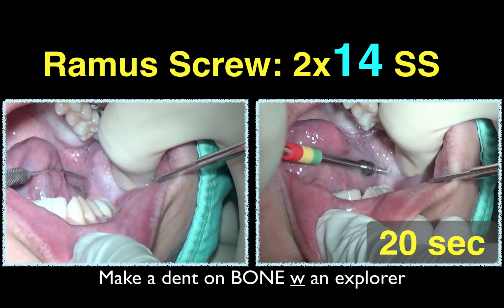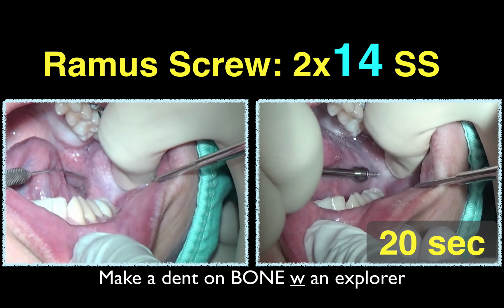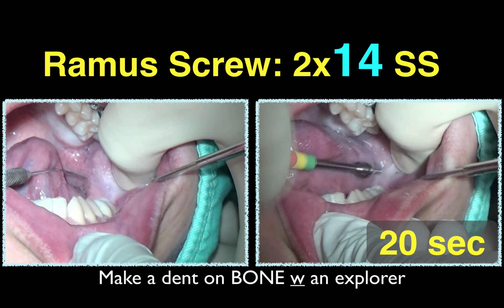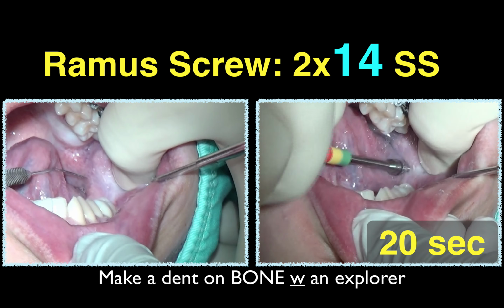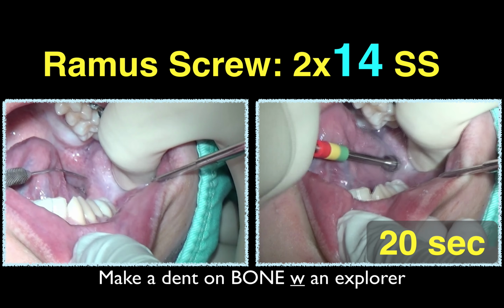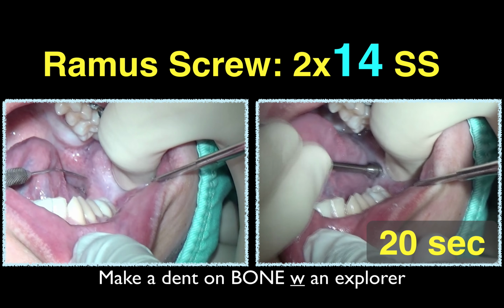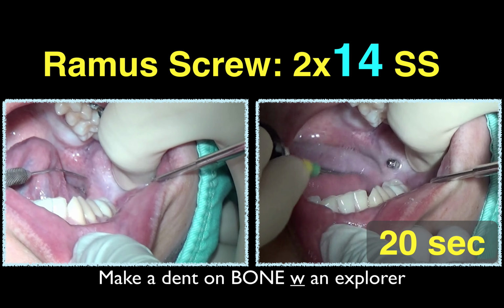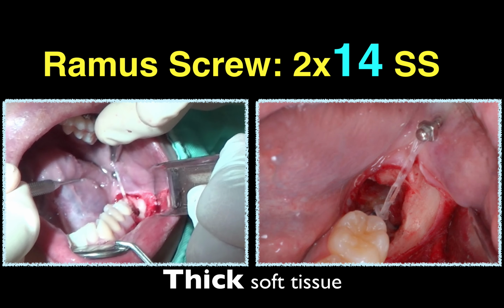And the key is you always use manual insertion, not machine. Because once you use a handpiece, the handpiece will entangle the soft tissue. Always use manual insertion. In order to use manual insertion, this screw has to be strong enough. And what kind of screw is strong enough? I would suggest stainless steel. It's flexible, it's strong. A strong screw can make our operation great. So I prefer a strong screw. And in 20 seconds, you're done.